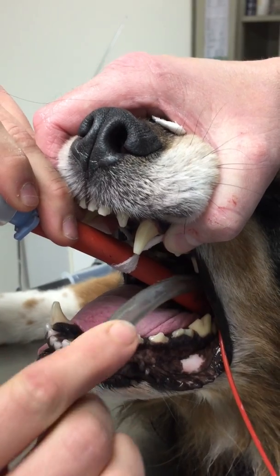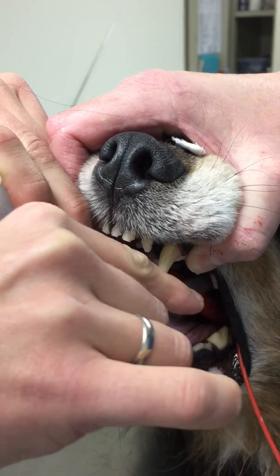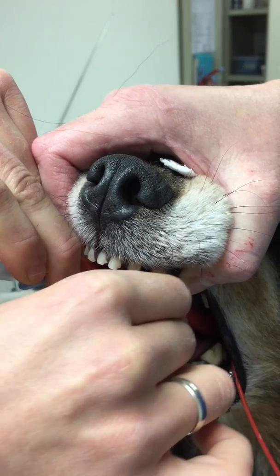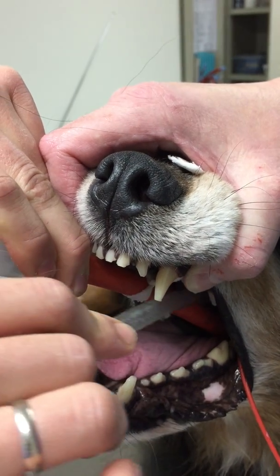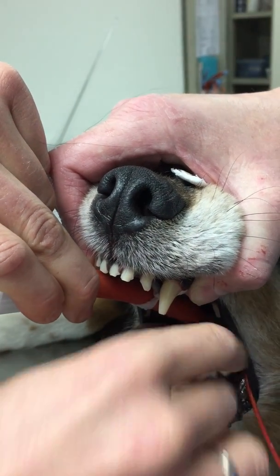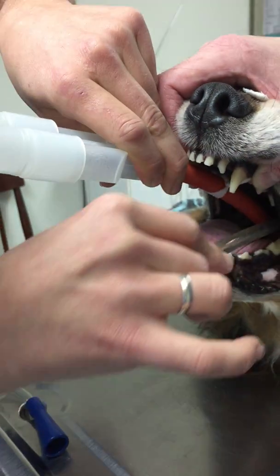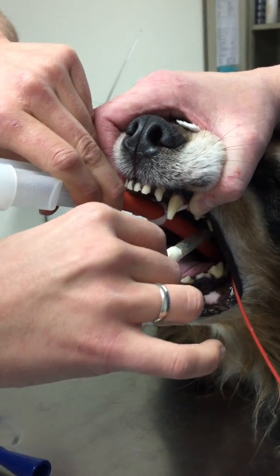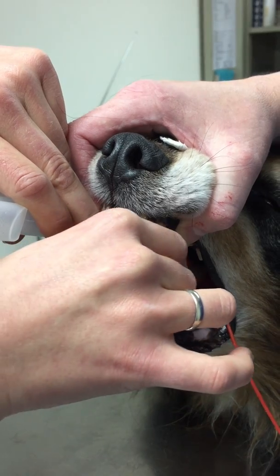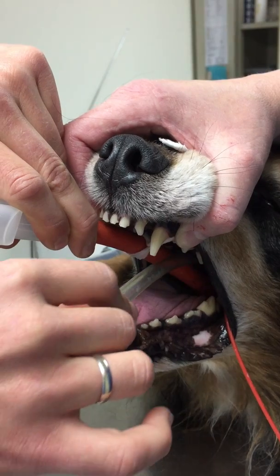We're gonna get it up. There we go — way down in. It's a long tube. There we go.